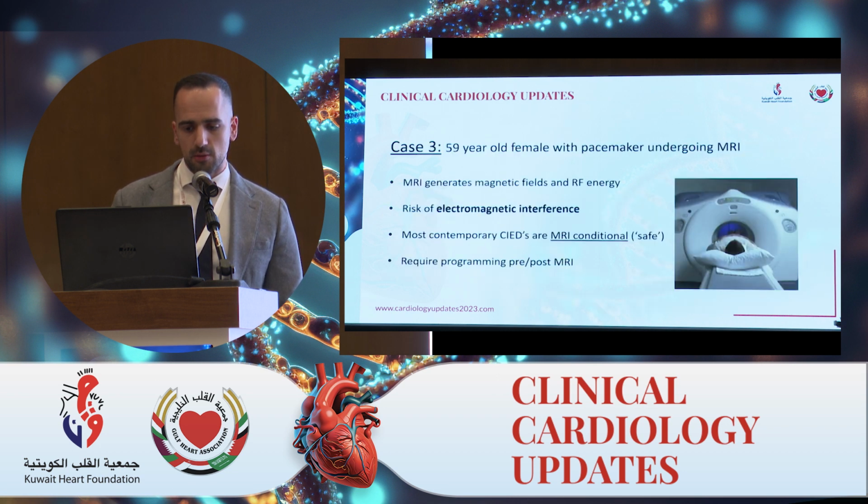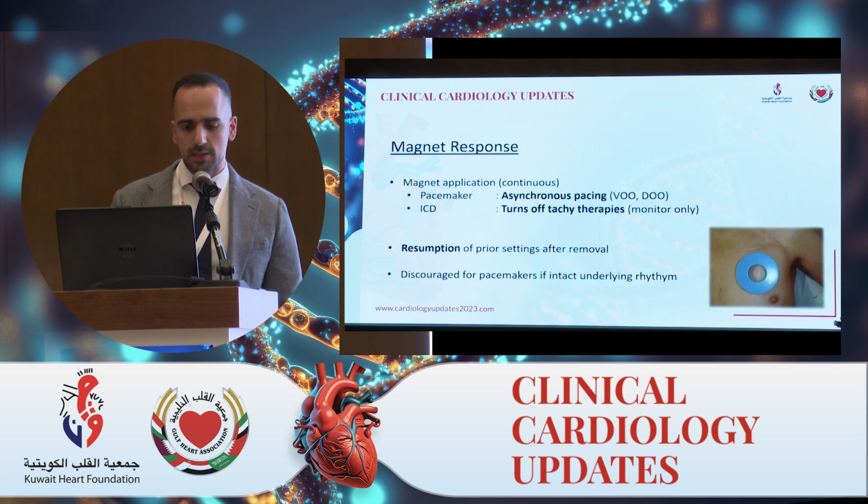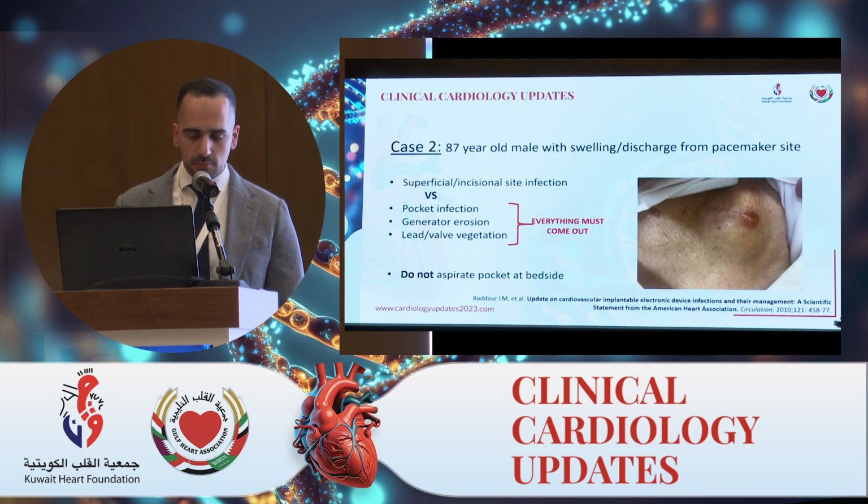And sorry, one last thing. Once you put a magnet on, that effect will stay as long as the magnet is on, but once you take it off, all prior settings will restore. You don't need to interrogate the device. However, it is encouraged for the device to be interrogated within a few weeks.